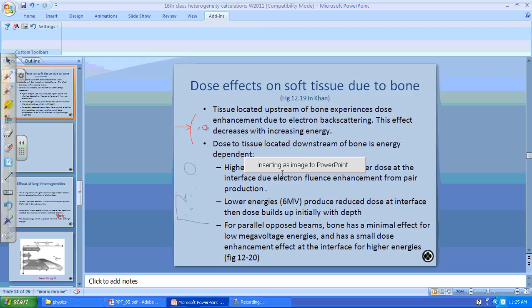Yeah, ask Theo about it, you guys are going to cover heterogeneity and how. So, if we're treating prostate with these metal implants and there's streaks and artifacts all over the place, what I tend to do right away is I'll window and level my CT scan, so I just see the metal implants. Okay, and knowing what the metal implants look like helps, because I know I'm expecting in the acetabulum this moon-shaped figure, and then I'm expecting a spherical figure, which is the femoral head, and then I'm expecting the stem. So you window and level until you have that shape, and then you contour that.